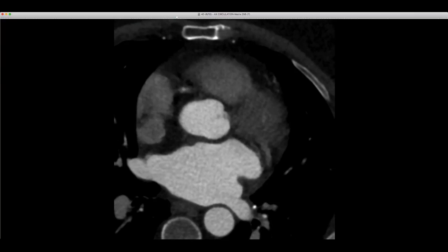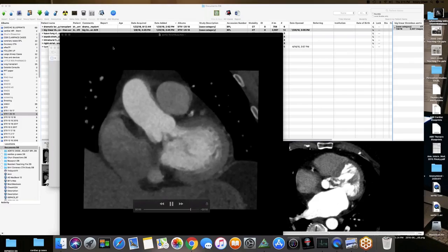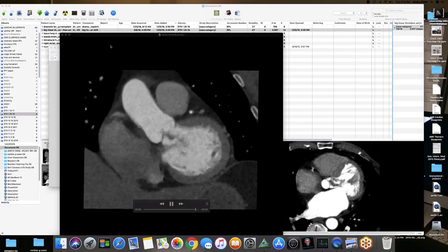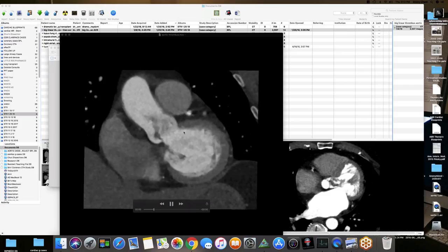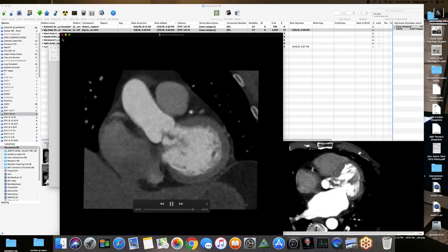On the cine loop, there's a fleck of calcium right at one of the valve commissures, right on the intima. That might have been a possible nidus. On the axial cine loop, there's a little fleck of calcium at about six o'clock. There must have been some nidus — maybe a lead point for the formation.